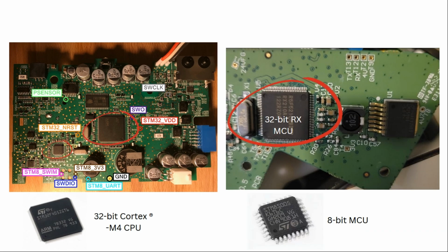As for what controls the CPAP machine, we have this main chip in the middle on the main board, which is a 32-bit Cortex M4 CPU. This handles a lot of the main functionality of the board, from interacting with memory, interacting with pressure sensors, and sending commands to the motor, and also interacting with another smaller auxiliary microcontroller unit, which basically offloads some of the work that the main microcontroller unit has so it can focus on other important things.